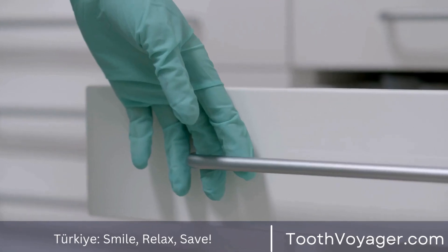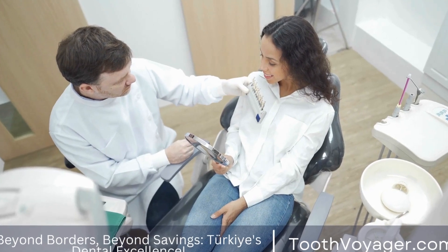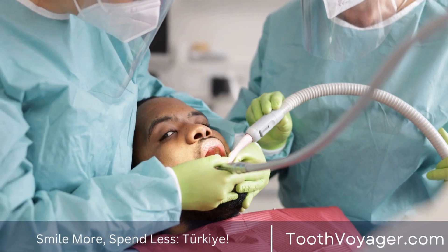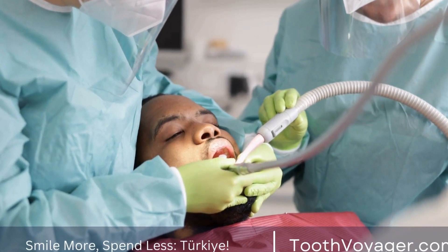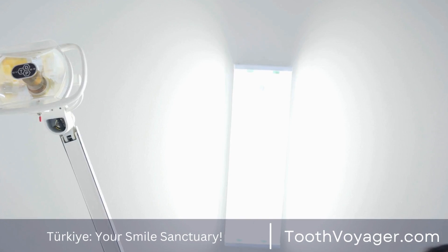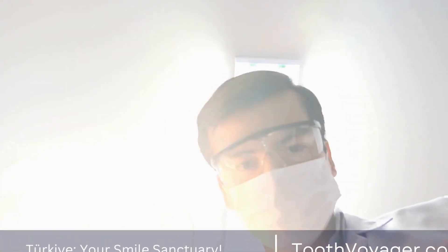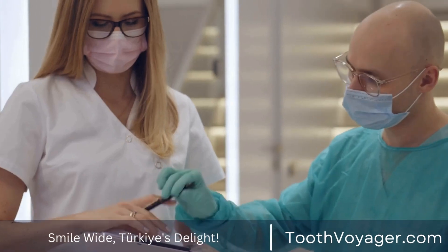Step 3: Implant Placement. Once the jawbone is ready, the dental implants can be placed. This is done through a surgical procedure in which the implants are inserted into the jawbone. The implants are then left to heal and integrate with the bone, a process known as osseointegration.